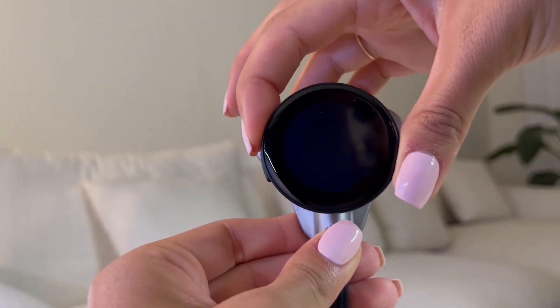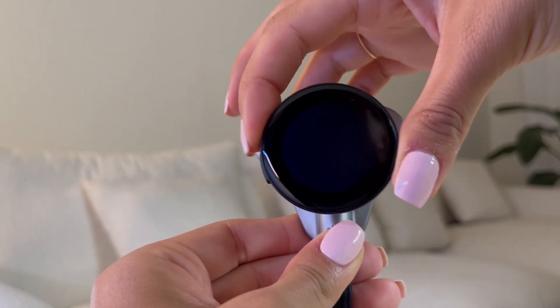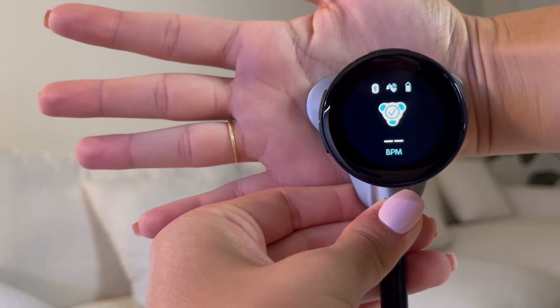Before we get into the details, let's talk about why digital stethoscopes are gaining so much popularity these days. They allow for amplified sound quality, background noise reduction, and the ability to record and share heart and lung sounds. These features are a game-changer for healthcare professionals, especially in telemedicine and remote patient monitoring scenarios. Now let's see how the Echocore 500 stands up from the rest.